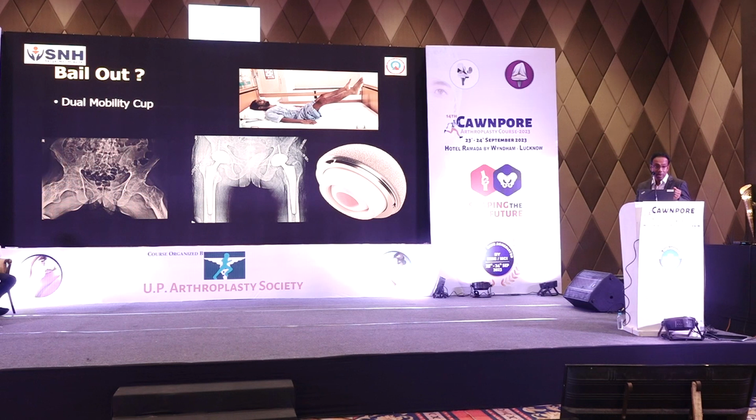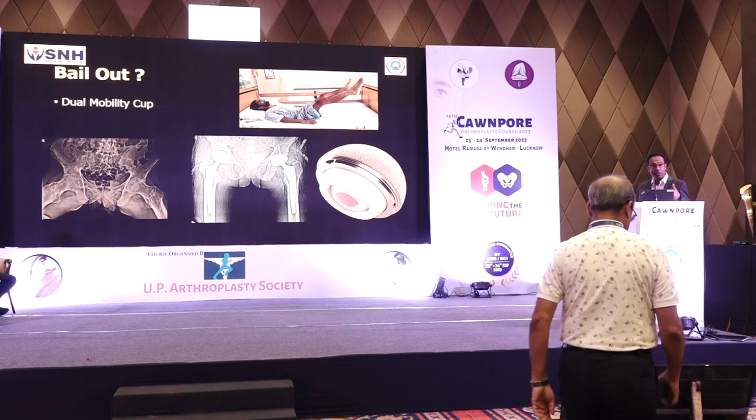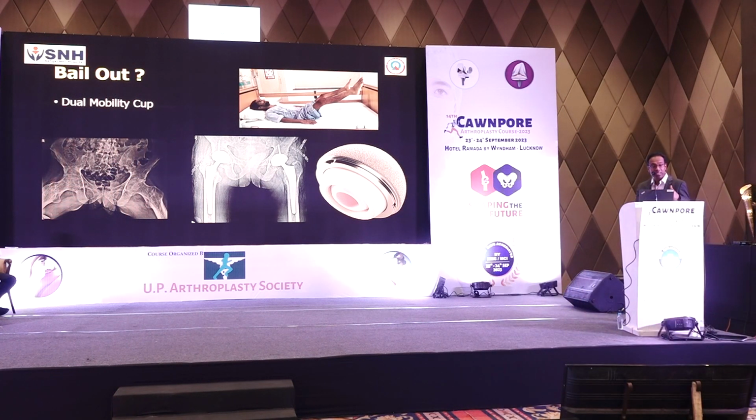Now the easiest solution for a simple orthopedic surgeon like me is to use a dual mobility in all the cases. But this is controversial mainly because dual mobility means more interfaces. Dual mobility also means we are looking at a technology which is new in the market, and we don't know whether survival is going to be as good. But then there is no talk without a controversy. And this is the 14th session of this arthroplasty conference. I hope to see you guys sometime next year, where we can discuss this further.